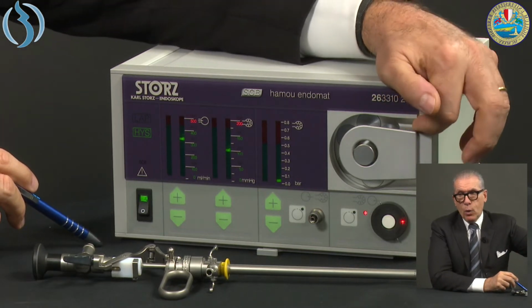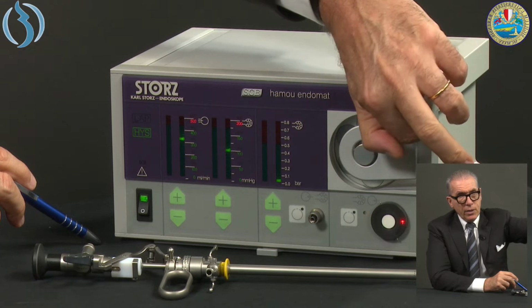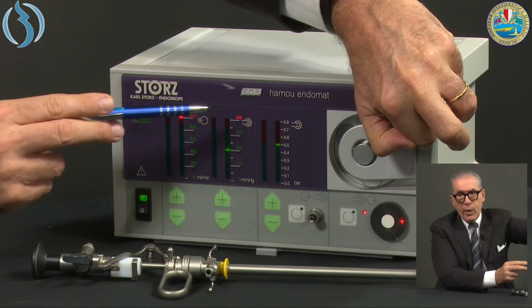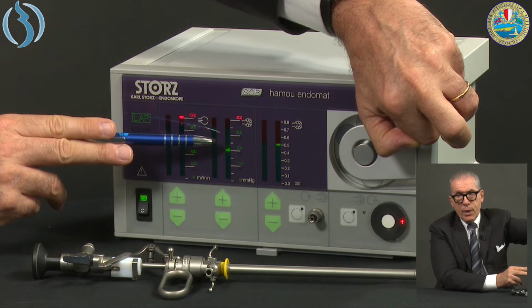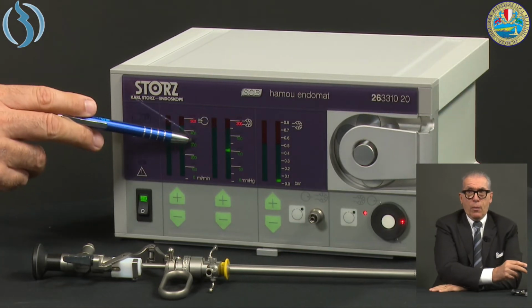In the tubing set, there is a small button here that changes the parameters of the pump. It's not easy to find. It sets a lap mode, and the lap mode means that other numbers are highlighted, which are exactly double the previous parameters. This is because in laparoscopy you need a higher flow and a higher pressure, while in hysteroscopy these parameters must be lower. So please don't use the laparoscopic tubing set in hysteroscopy, because the parameters will be totally wrong and the patient's health can be in danger.